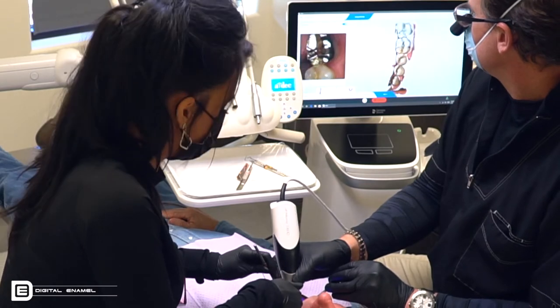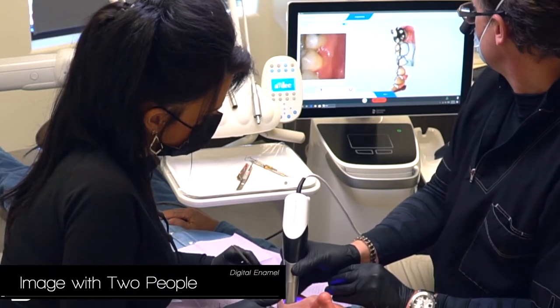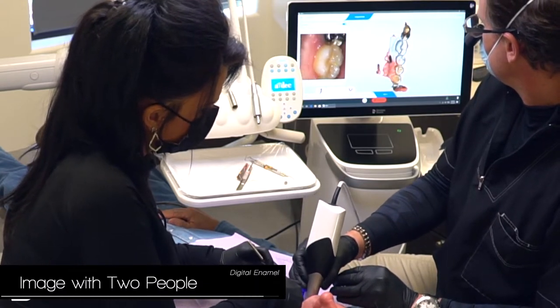Something else that I think will help you out tremendously is to image with two people. I know you can totally do it with one person. I've done it many, many times. But if you have another person walking around the hallway, an assistant, somebody else, a hygienist, God forbid a hygienist has to sit down and help scan something. Just kidding, hygienist. Hopefully my hygienist didn't hear me say that. But if you could have one other person sit down, maybe they can help retract the cheek.